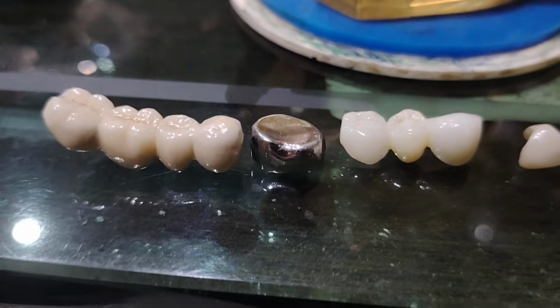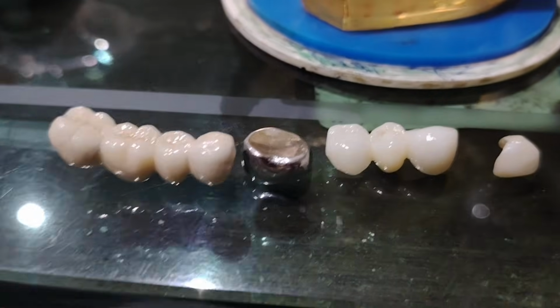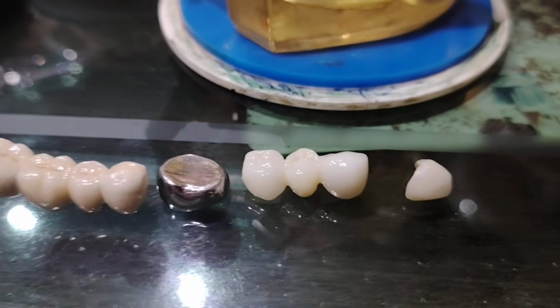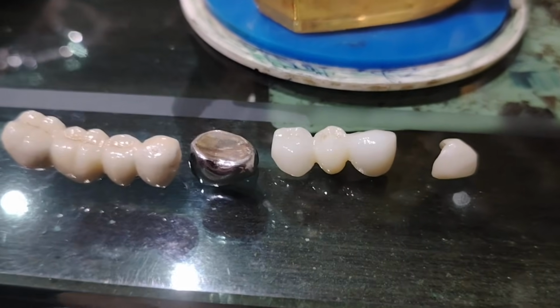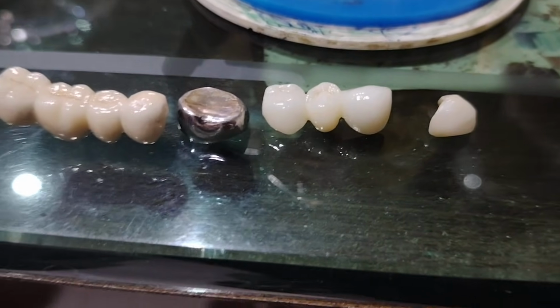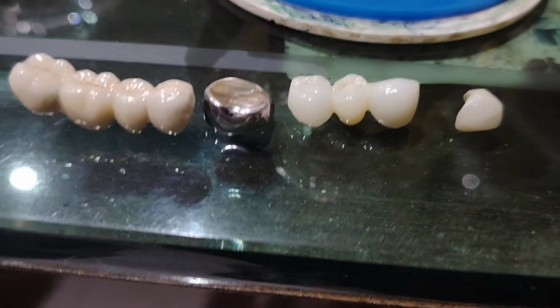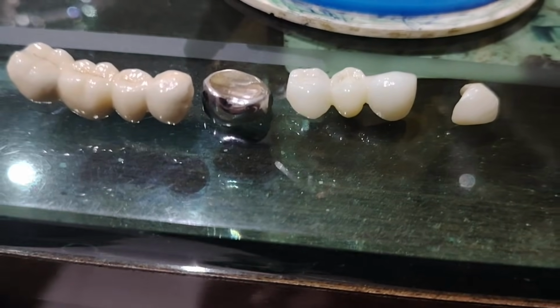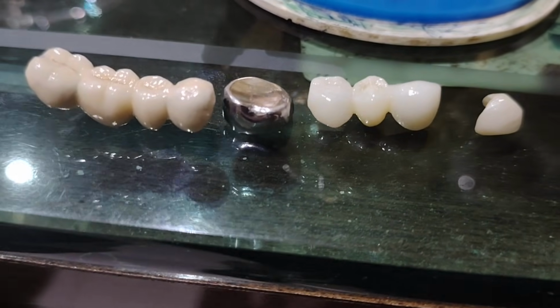Okay, for today's discussion, I have one topic that is fixed partial dentures, the prosthetic part of it, crowns and bridges. So after RCTs or for aesthetic purposes, we do the crown preparation. Now I will be telling you what are all the materials available for crowns and bridges.